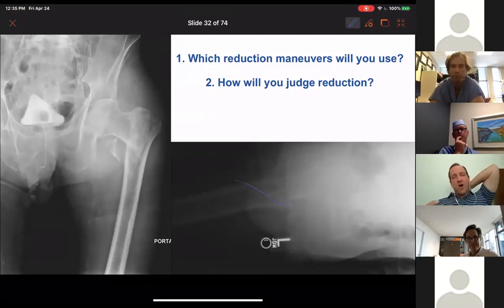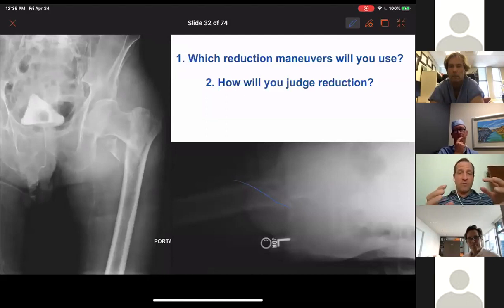So what I found is often traction, can you hear me? Do I lock up? Yeah, I'm good. Often traction will lock that fracture line into place. That's often not in the right position. So it's hard to assess that. And I think it's hard to reduce that obliquity, basically. So I'll pull traction, and, like Tom said, you can often make the fracture line on the AP look better with internal rotation, but you can over internally rotate and not realize it radiographically too.